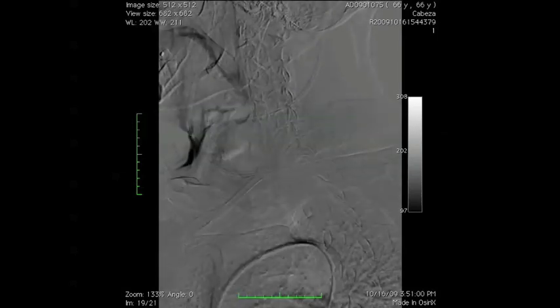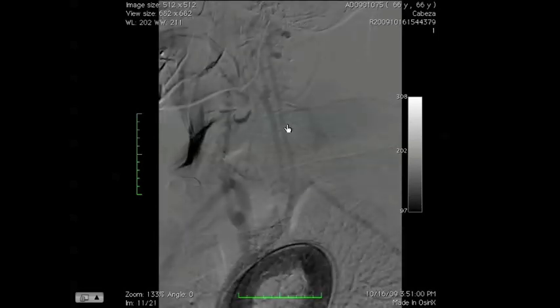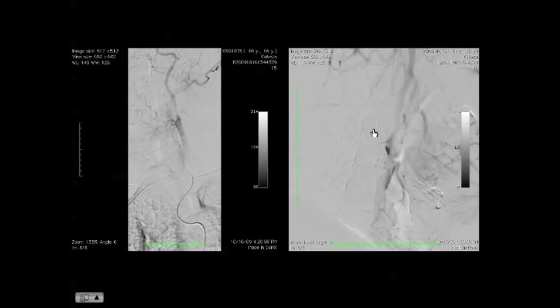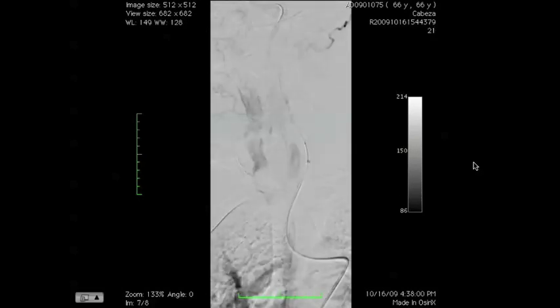We had the chance to do some cases in Argentina. Here is a carotid case — carotid angioplasty in a patient with challenging anatomy using this particular device. There is a very tight stenosis; the patient had a contralateral 100% occlusion of the carotid artery. Through the diagnostic catheter we advanced the 0.014 into the external carotid, and then we were able to advance the 0.035.